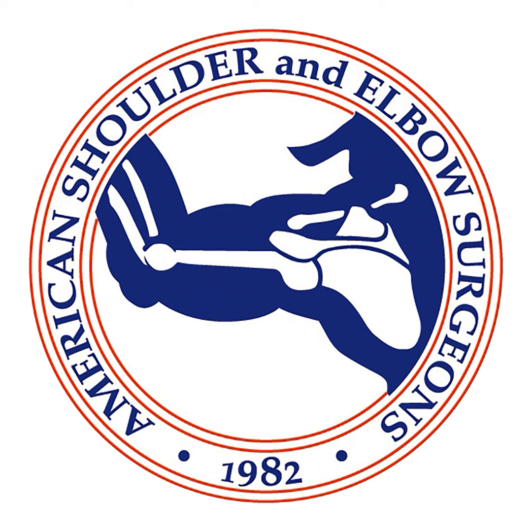In terms of the advantages, I think John hit on all the major points, but there are a couple of others. The risk of an intraoperative fracture, like I talked about just a couple of minutes ago, is much, much less with a stemless. Certainly, there's no risk of a humeral shaft intraoperative iatrogenic fracture like you would have with a press-fit stem, so that's nice. There's also less risk, I think, of stress shielding postoperatively, because that bone is getting loaded differently than a stemmed implant that has fixation distally, a diaphyseal fit, which is a pretty common mode of fixation for a lot of stems out there.